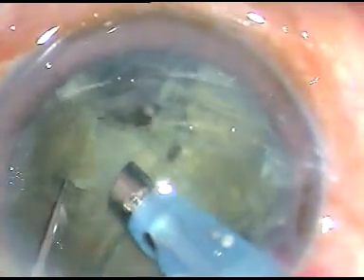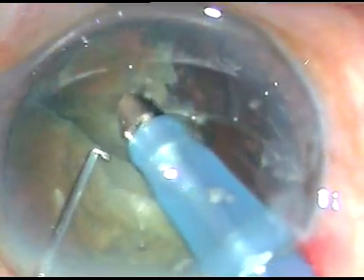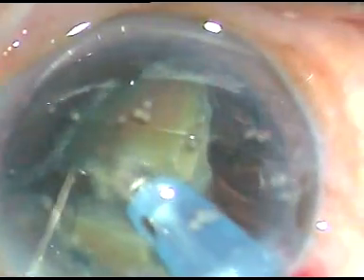In this case, how it occurred, I am not very sure, but probably one reason may be that I was a bit in a hurry and I could not take proper care of the anterior chamber stability. See, PC rent has occurred at this moment. How it occurred, I was quite far from the posterior capsule, so I'm not sure how it occurred.